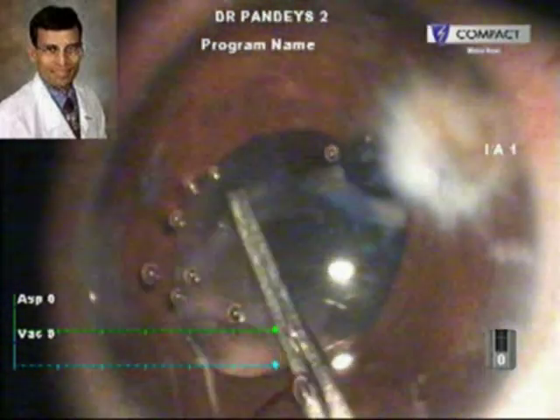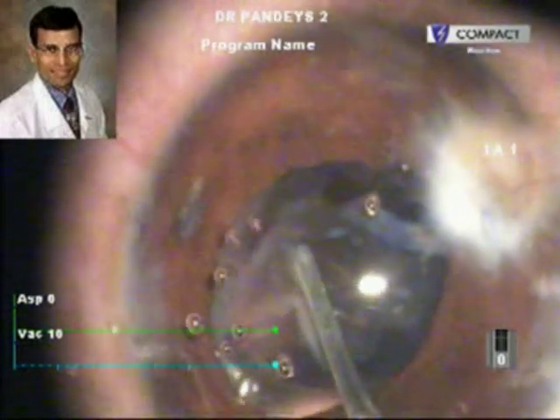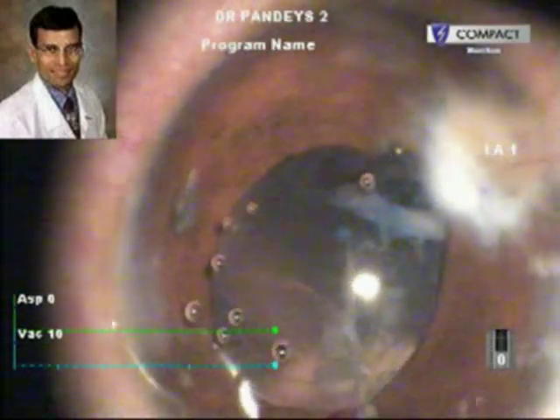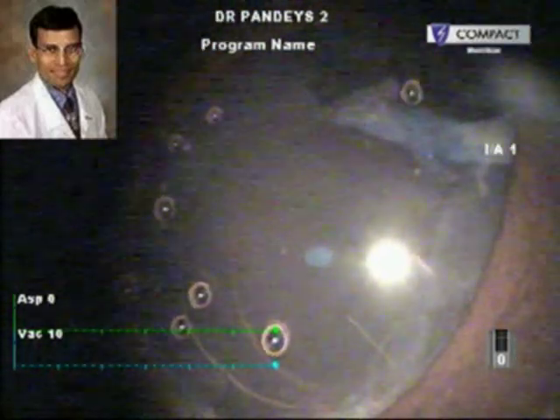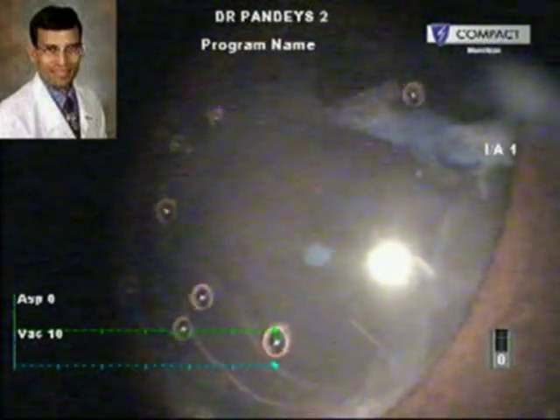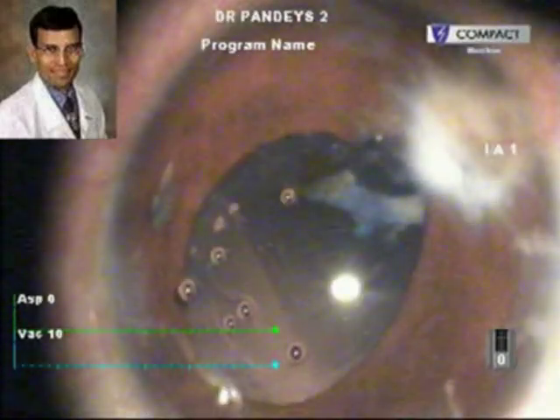Here you can see that the posterior plaque is coming out even while the surgeon was actually attempting the capsular rhexis. The entire posterior capsule plaque has been removed, and this achieves a very good visual axis. This would be very helpful for the child during the post-operative period because there would be no risk of obstruction of the visual axis due to posterior capsule opacification.